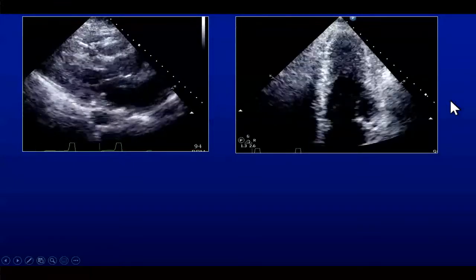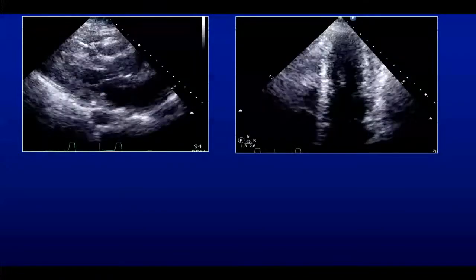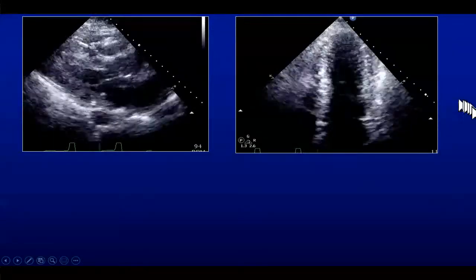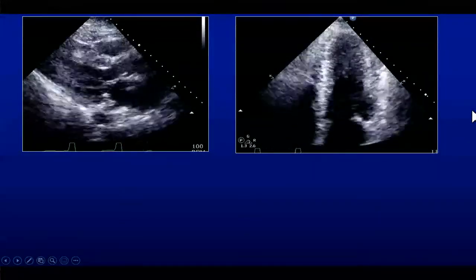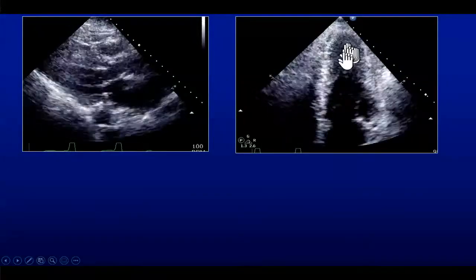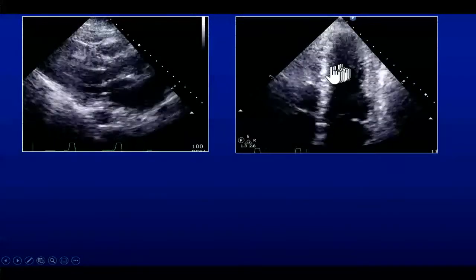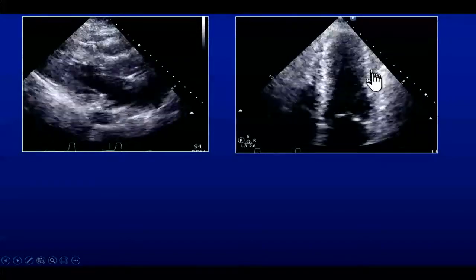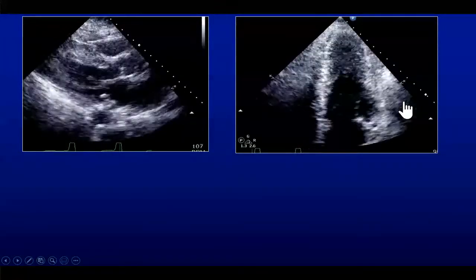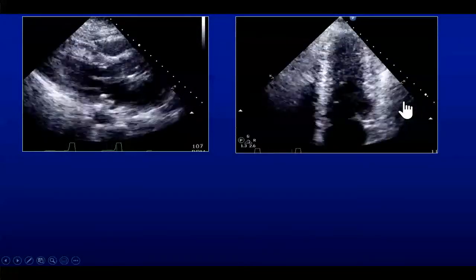And tell me what you think. You can scream it out and I will say it. Apical HCM, very important. That's a suspicion. You don't have a diagnosis, but that's a suspicion. And the suspicion is there may be crowding here, but there's a definite abnormality, which, if you're an expert in interpreting wall motion, take a look at the epicardial motion of this heart on the outside of the ventricle. There's no motion. Remember, there's always motion of the epicardium, right?